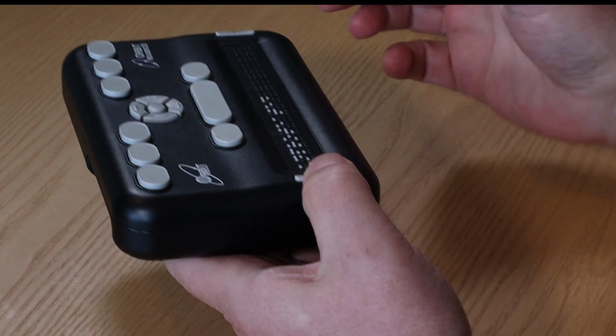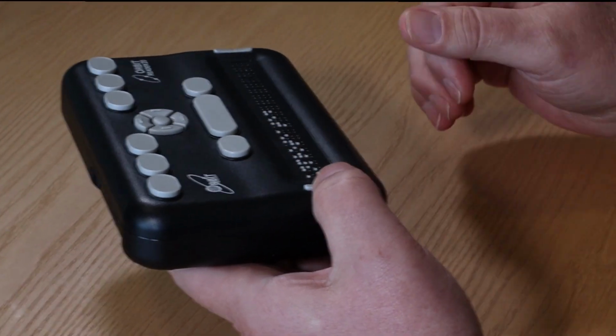Very powerful for a person who prefers to do Braille rather than speech, or with speech. Or if a person's deafblind, they really need a device like this to be able to use a smartphone or a computer, and they can also use it to communicate one-on-one. You could send a text message, I could read it, type it back on this device, and send it to you just using this device, and we could have a conversation.